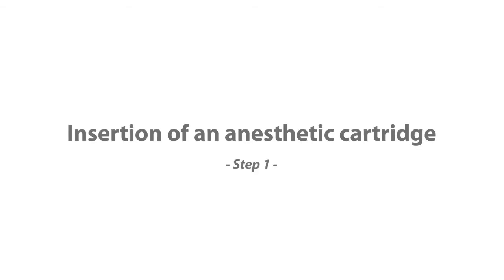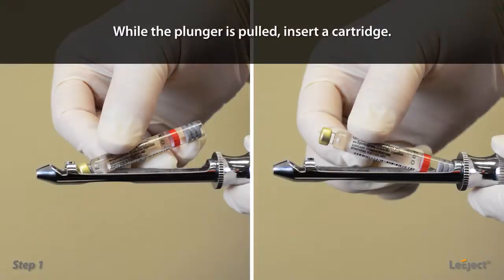Insertion of an anesthetic cartridge: while the plunger is pulled, insert a cartridge.